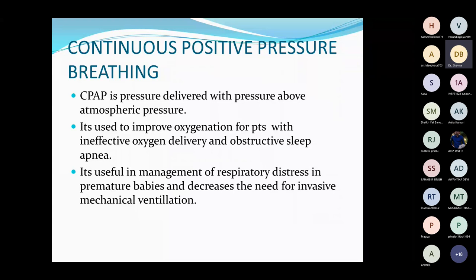So CPAP is where it is continuous. The name suggests continuous positive pressure breathing. The machine continuously generates positive pressure inside the lungs. It is used to improve oxygenation for patients with ineffective oxygen delivery and obstructive sleep apnea, who have disturbance in the night because of the oxygen. They cannot have a sound sleep because of the hypoxia or a lack of oxygen during the night. So for those patients, CPAP is advised.